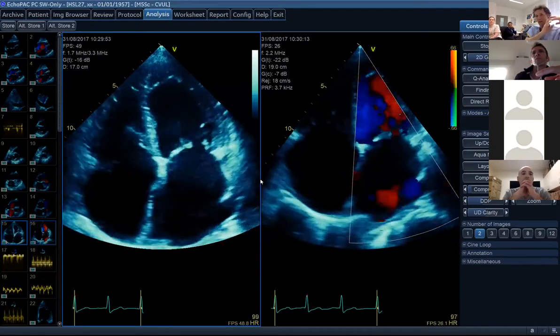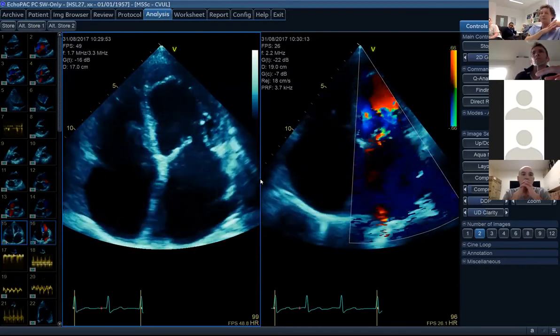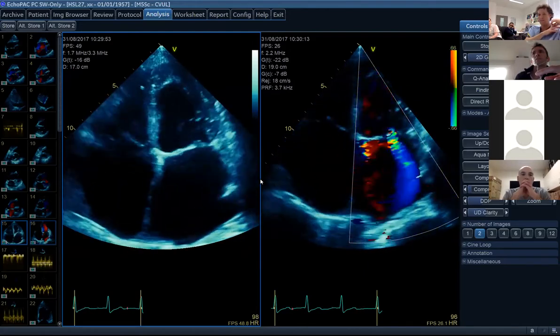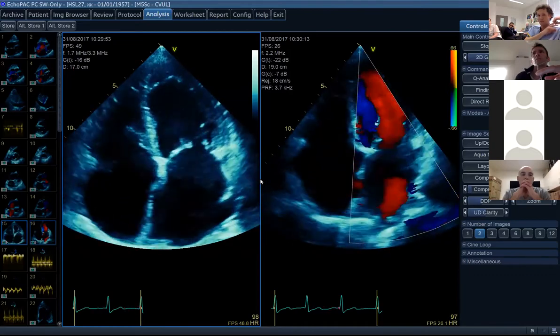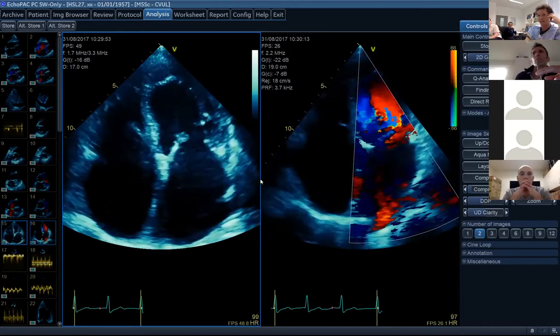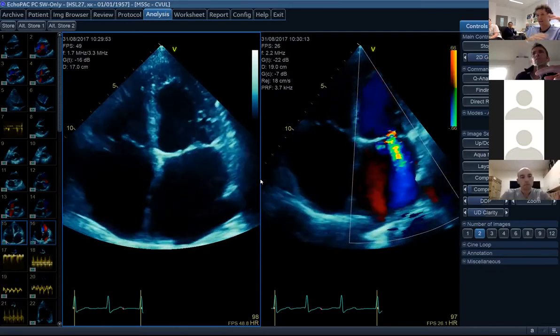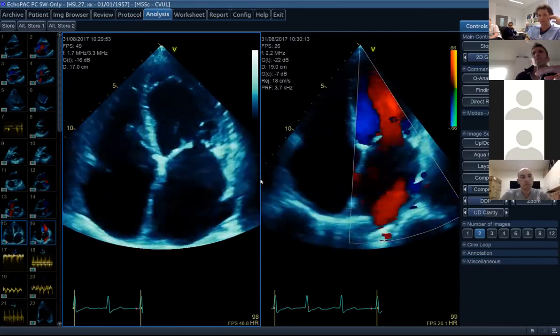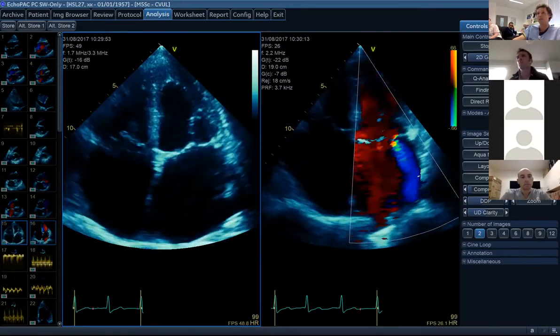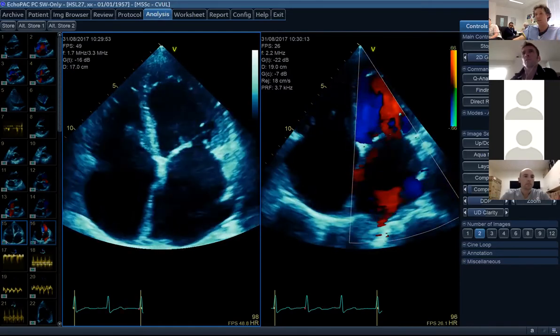The second thing is with that color Doppler, it looks like it could be quite significant mitral regurg based on this alone, but it's likely we're still underestimating it because of the severity of the left atrial pressure. I think we can see there's probably a significant PISA potentially being formed from that central jet coming back through and hitting the back wall, all of which suggests this could be a fluid overloaded state. So excellent. And then the final thing you talked about was the dilated right ventricle. So really nice. Okay, Lee, we'll go for the next person if that's okay.